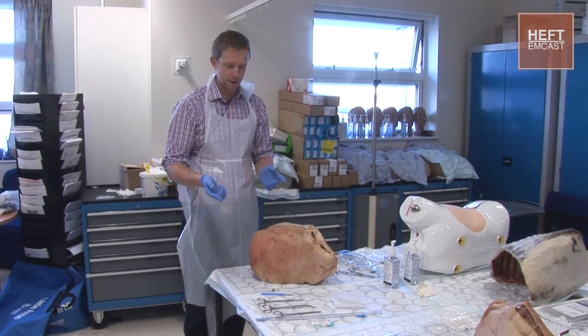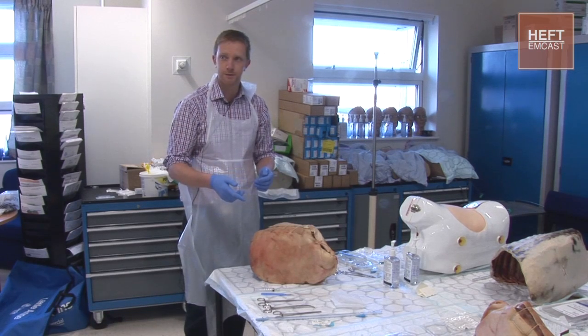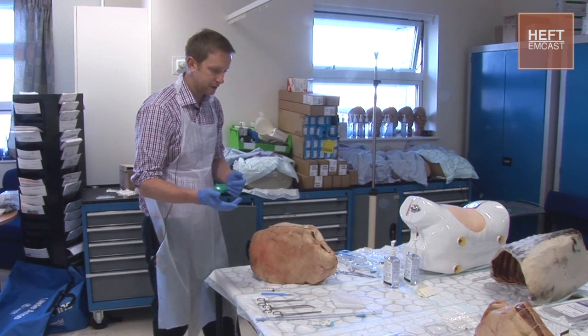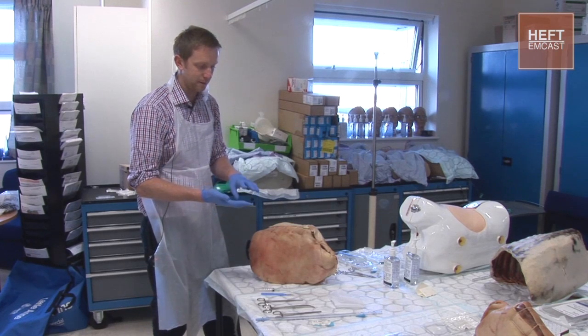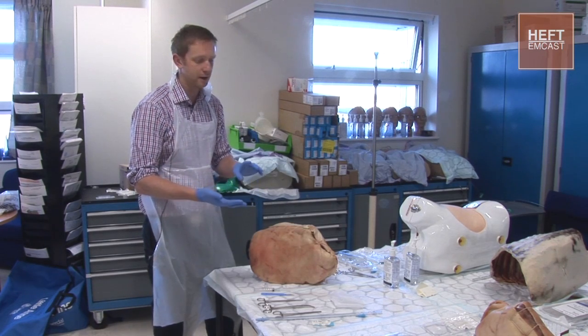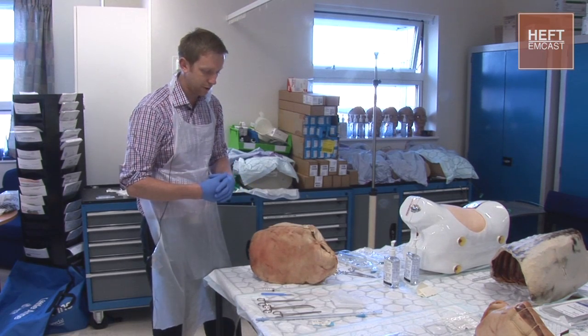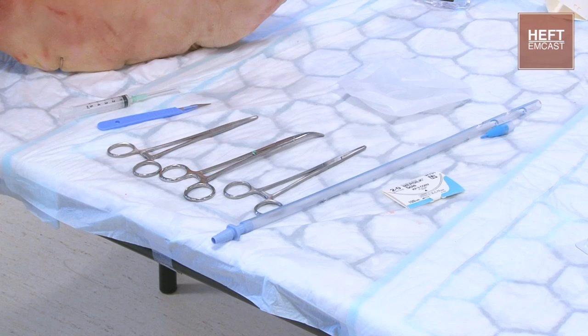I'm going to talk a bit about the equipment to start with, and then we'll go through how to perform the procedure and what we're going to be doing. We need to start off by having a chat with the patient, discussing the indications for the chest drain, making them aware of what's going to happen, gaining their consent, and then we'll check our equipment.